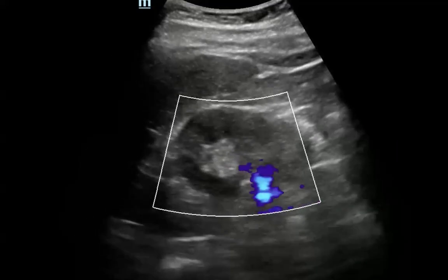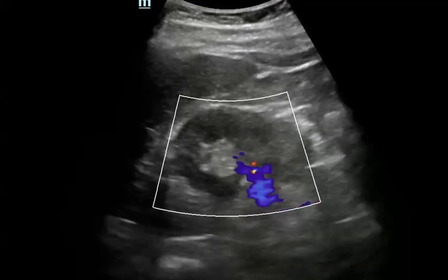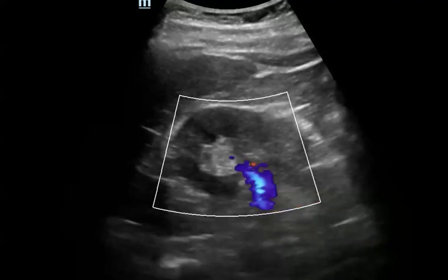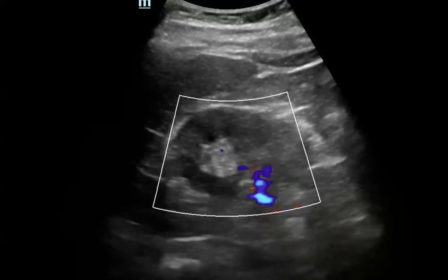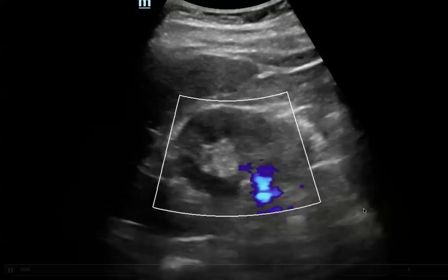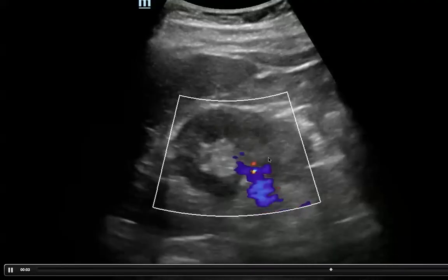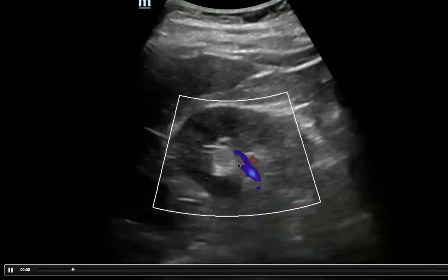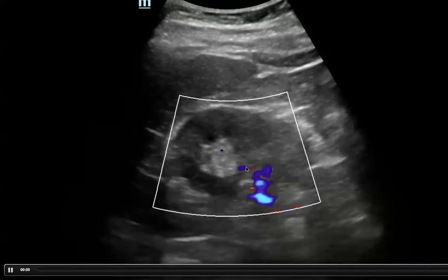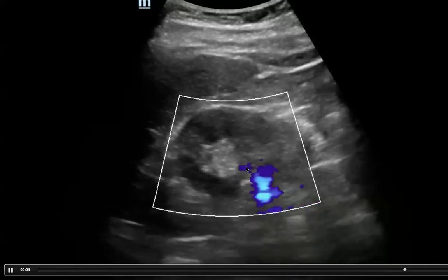Now here is an example of the sonographer using color Doppler centered on the kidney. The reason why is because, well, oftentimes if you're worried about mild hydro and you see a little bit of black sort of blown calyces in the middle or something that you suspect has blown calyces, you can put color Doppler over the kidney and see if those black areas light up with color, red or blue, right? And so if it does light up, that means these are just prominent renal vasculature, and this is a normal variant.